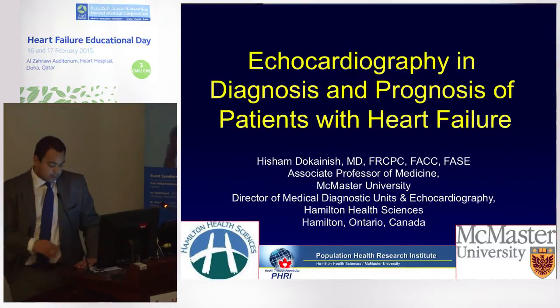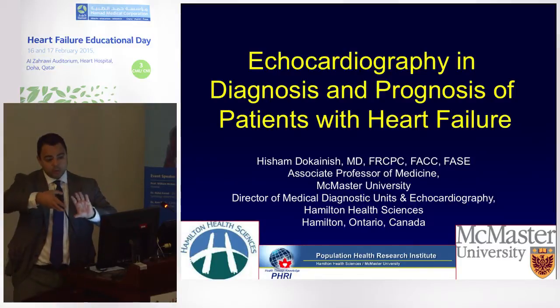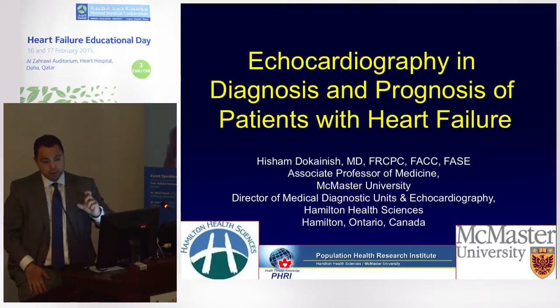That's a brilliant question. There's very good work done by one of my mentors, Sharif Naga, on the twist and untwist of the ventricle. For simplicity's sake, in a normal ejection fraction, the diastolic untwisting seems to be, as well as the longitudinal relaxation, fundamentally important and correlated with filling pressures in a patient with preserved EF. So if someone has preserved EF, the more depressed the diastolic untwist rate is, the more likely that person is a candidate for diastolic heart failure. We do not clinically, routinely measure twist untwist.